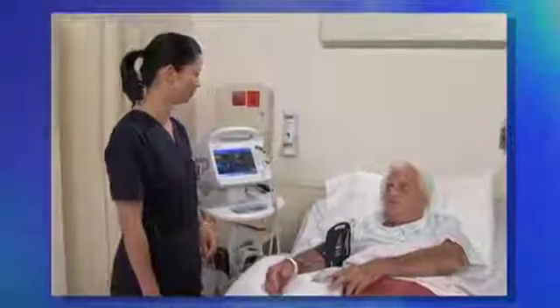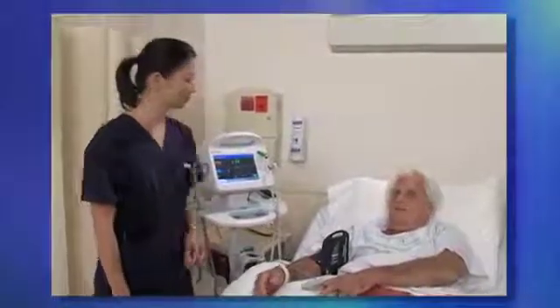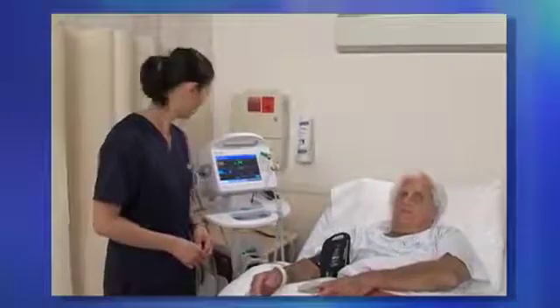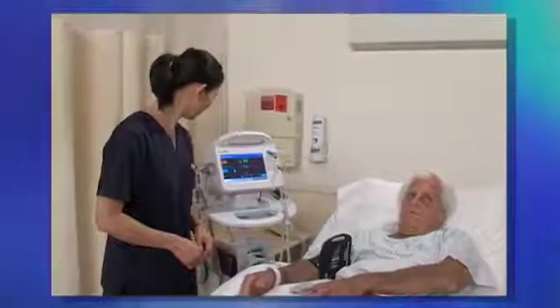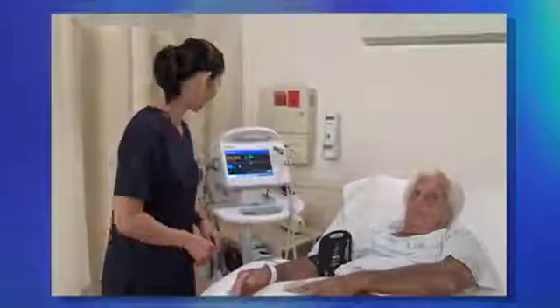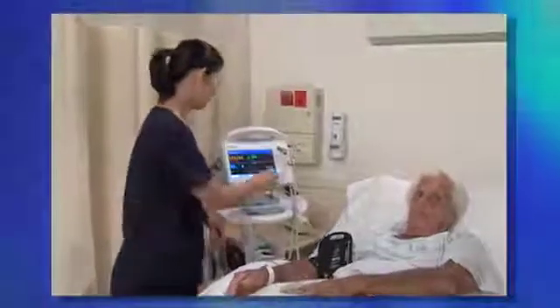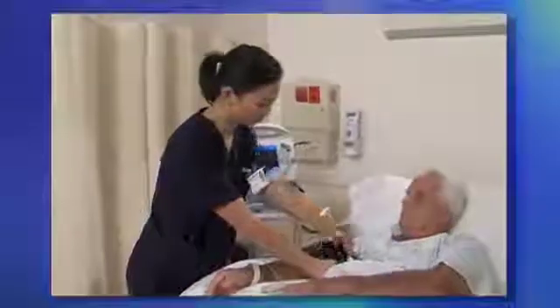In this program, the first of a two-part series, we will discuss measuring temperature, pulse, and respiration. The other vital signs, blood pressure and pain, will be discussed in Vital Signs Part 2.